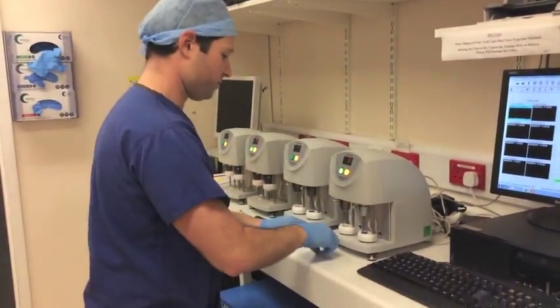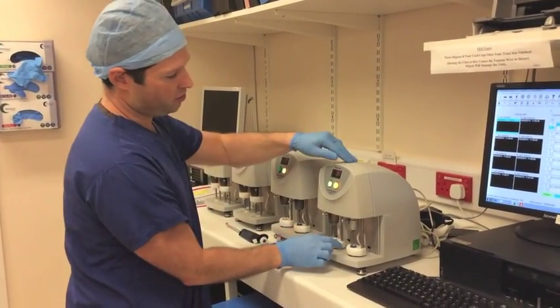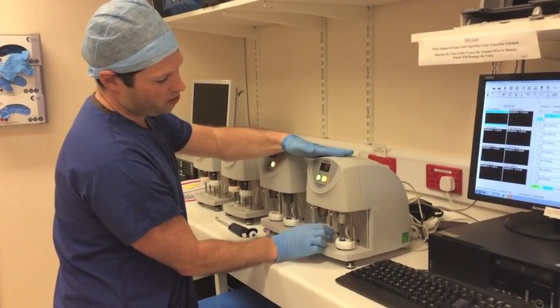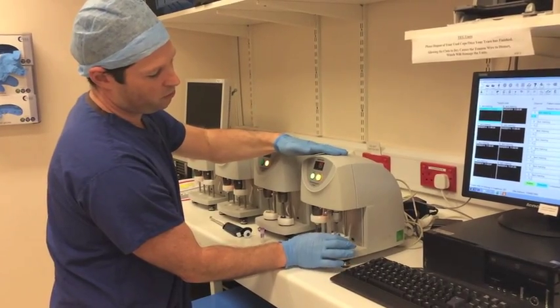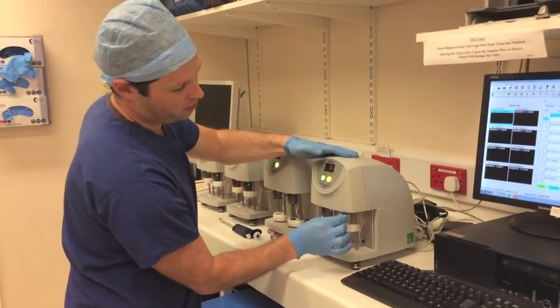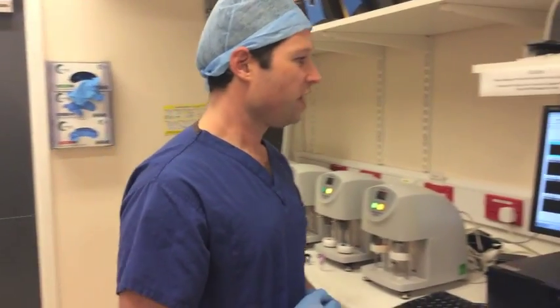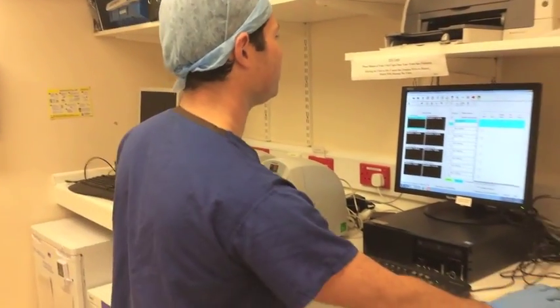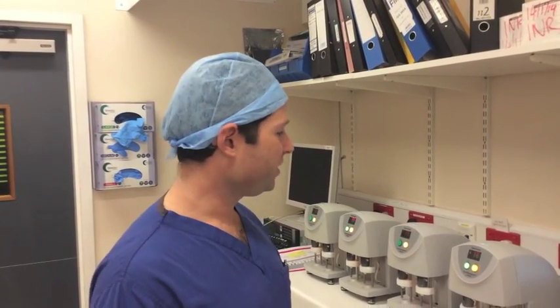We then need to load our samples and we can start. Hand on top, we load our sample and put this across to test. Hand on top, we load our sample and go across to test. The traces are now ready to be run, and we now need to start the trace. We've now loaded our blood samples into the thromboelastograph and it is now going to be starting our trace.